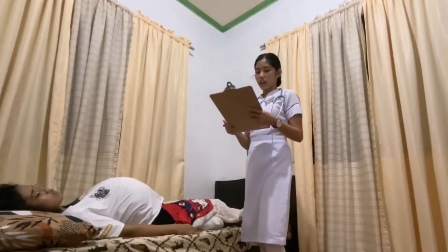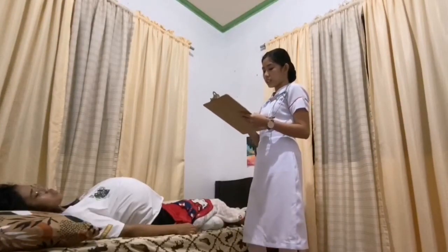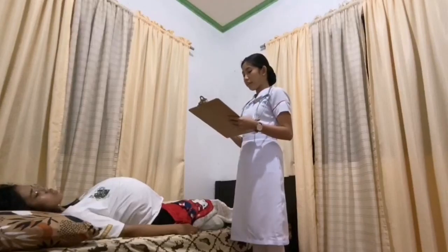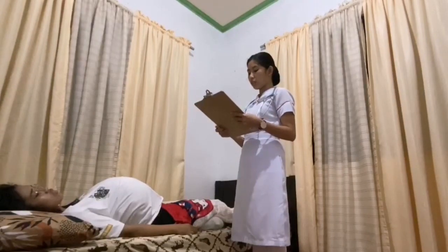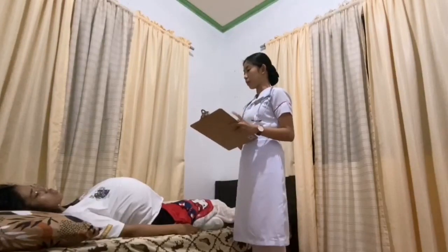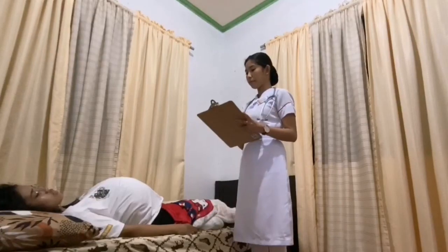So ma'am, for this taking of fetal heart tone using a stethoscope, today po is September 20, 2023, 10 o'clock in the morning. So, as I have checked naman po, and auscultated, it is 140 beats per minute, which is normal, under the range of 120 to 160 beats per minute. Thank you, ma'am.